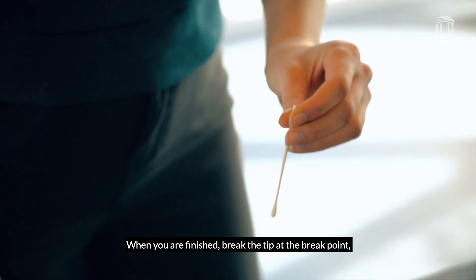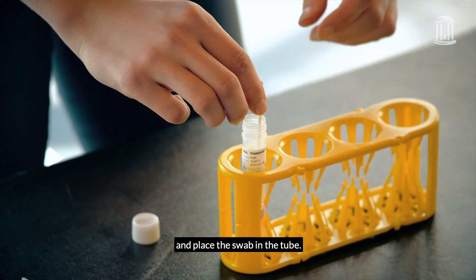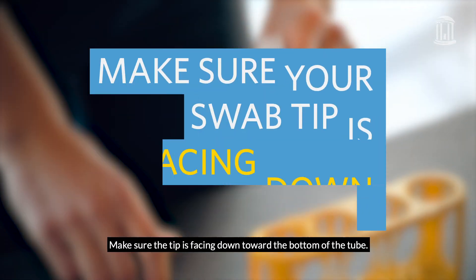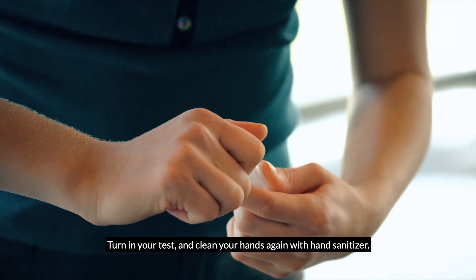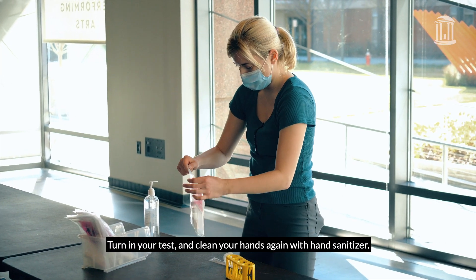When you are finished, break the tip at the break point and place the swab in the tube. Make sure the tip is facing down toward the bottom of the tube. Screw the tube top back on tightly. Turn in your test and clean your hands again with hand sanitizer.